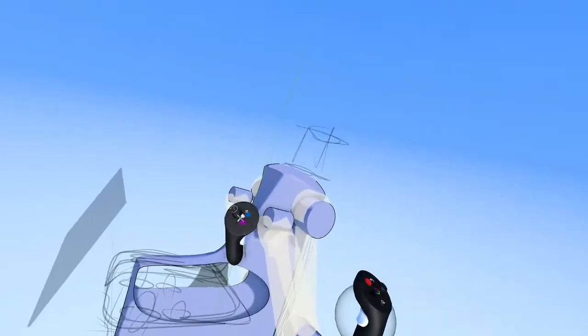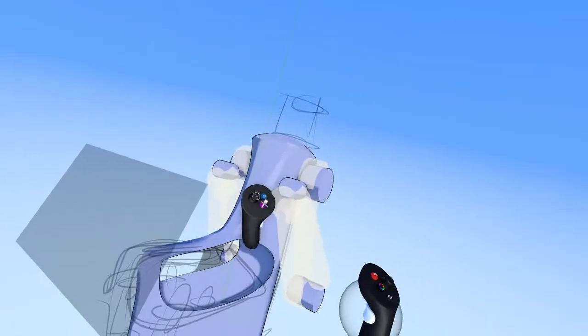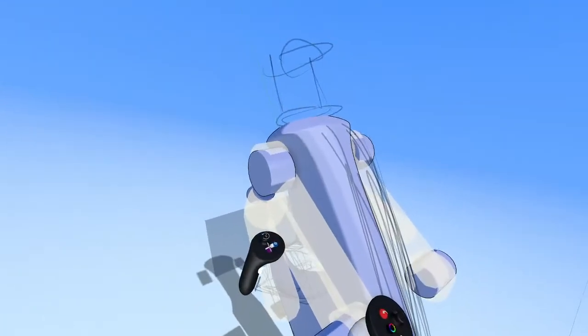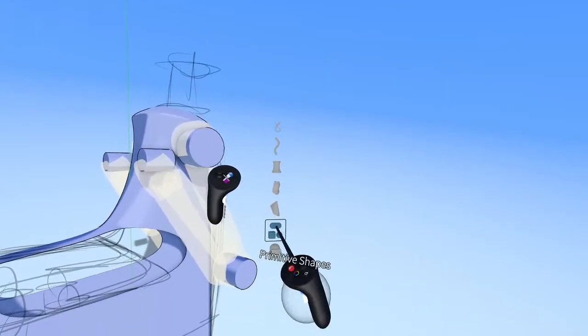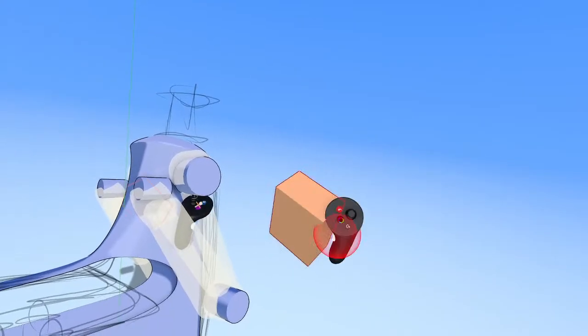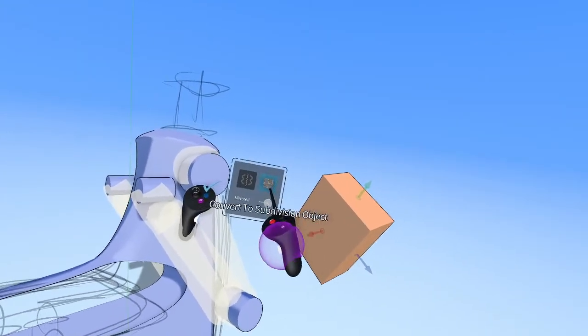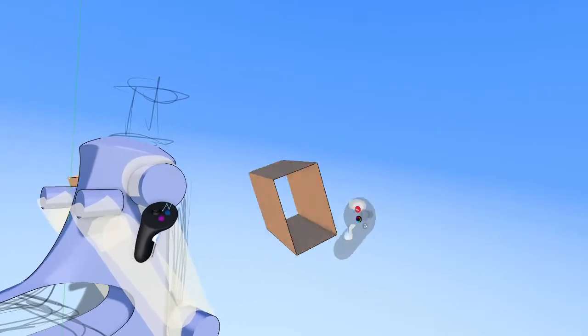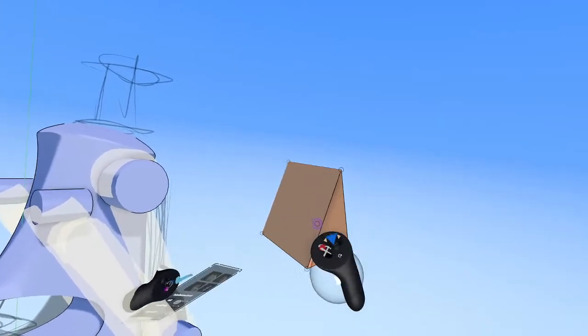All right, so we're gonna do a little bit of experimental surfacing for the arms here. So what we're gonna do actually is just start off with a cube. We'll just drop that in here like this, and then grab it, turn it into sub D, and delete the faces. So now we have this tube-like shape. And let's delete an edge.